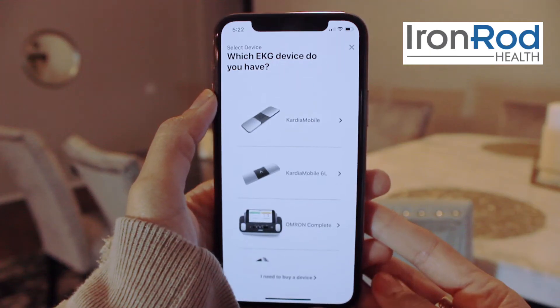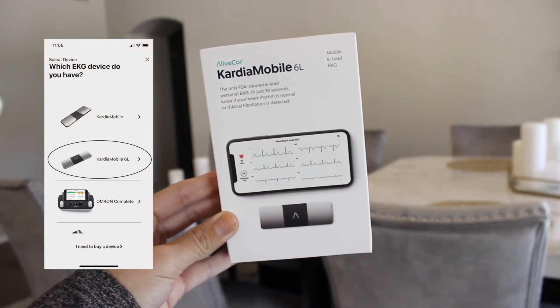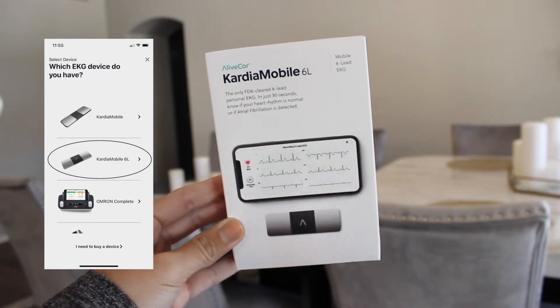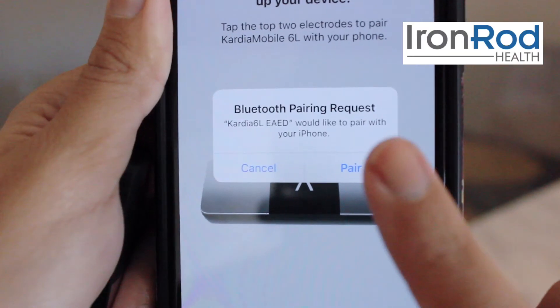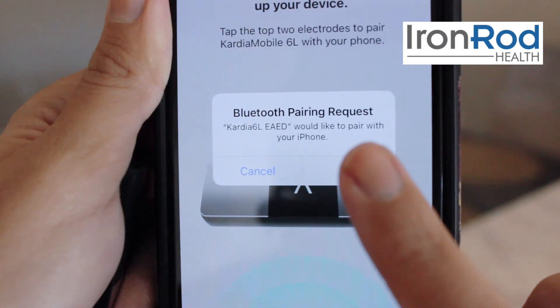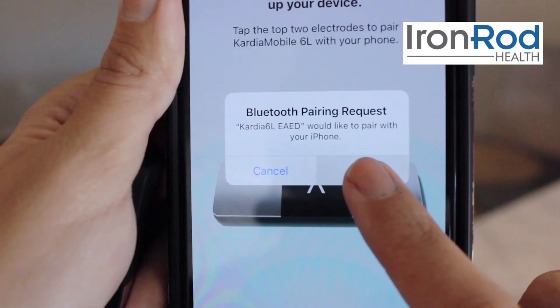On this next page, you'll see different devices to choose from. We are going to select the Cardia Mobile 6L. A pop-up might appear asking to pair your device via Bluetooth. Be sure to select pair on the right so your readings can be taken.